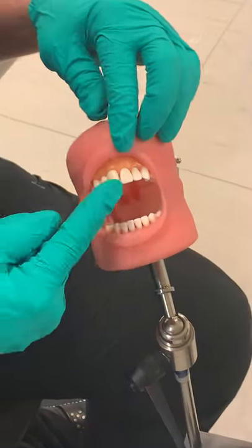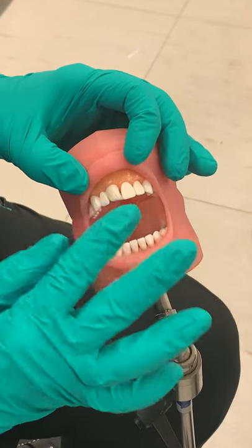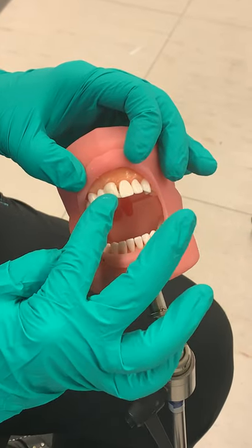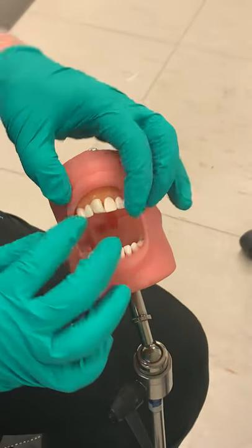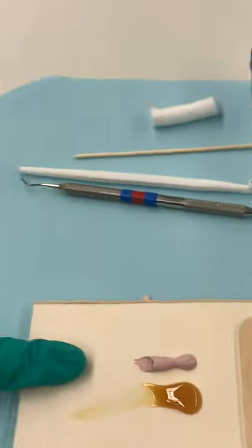We're going to be doing a perio pack for tooth number eight, which is our surgery site. As far as placing the perio pack, we want to go one tooth and a quarter past the surgery site. So we're going to do eight, seven, and a little bit of six, and then nine and a little bit of ten. First we want to make sure we mix our perio pack.